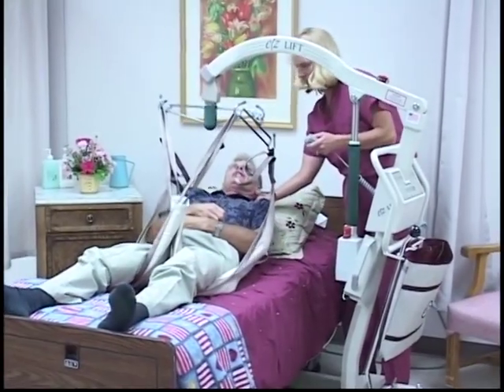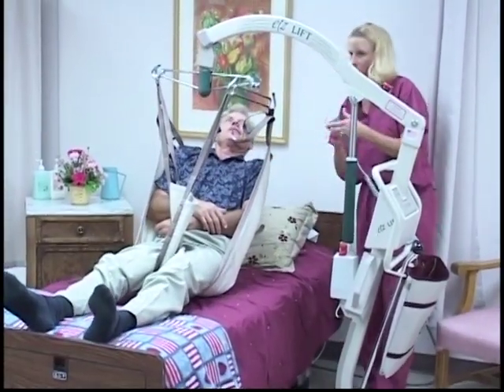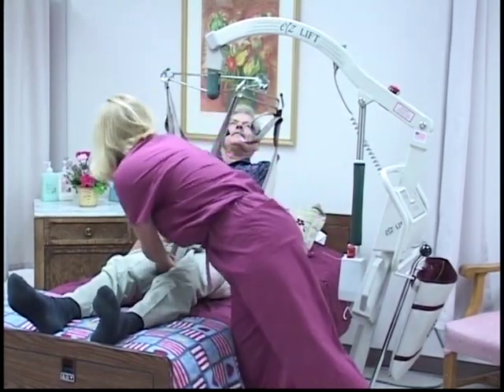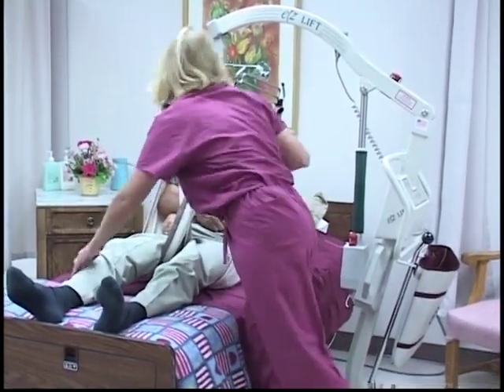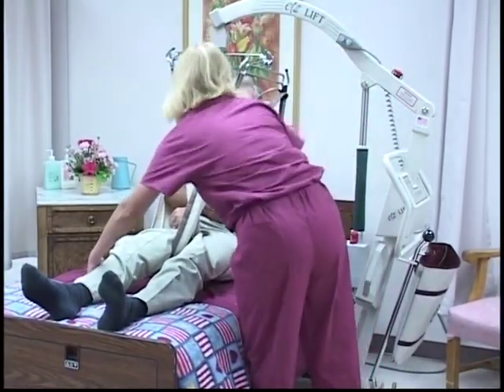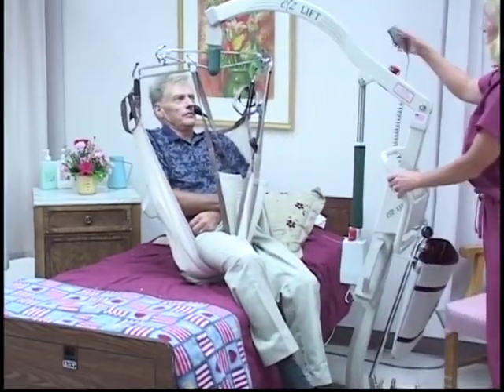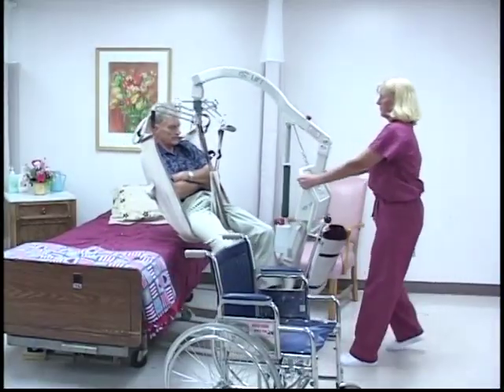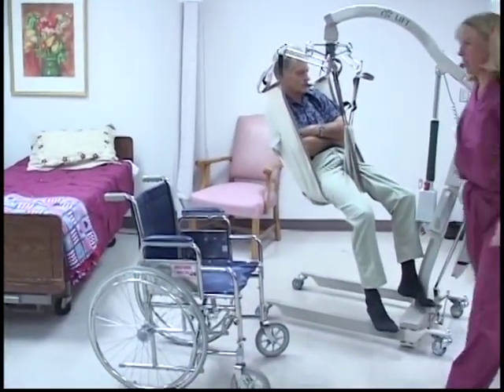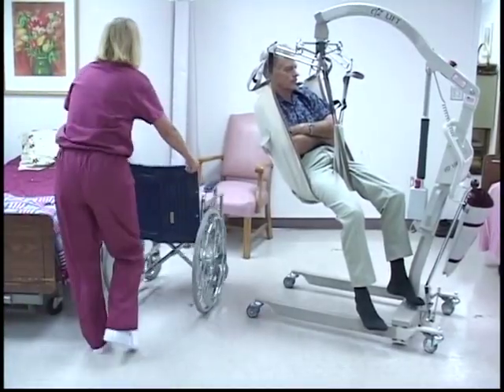Push the up button on the hand control. Once there is tension on the loop, double-check the loops to make sure they are securely in the hooks. Start lifting the patient to the desired height. If the patient is not able to support their head, assist them or use a head support sling. Lift the patient's knees and smooth out the sling under the thighs. Then, continue lifting the patient to the desired height. There may be instances when patients with extremely fragile skin will require a different sling, such as a multi-purpose sling.